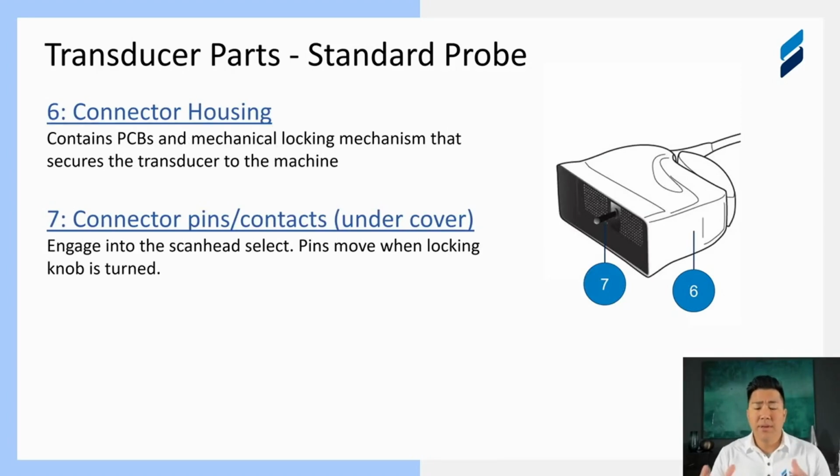Here we really have a connector of a transducer. We're not talking wireless. We're talking standard transducers that are used on really premium ultrasound machines, and they have connectors. And this connector we've actually broken out to be a connector housing, which is what's also called a can.